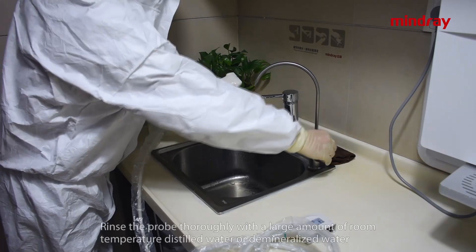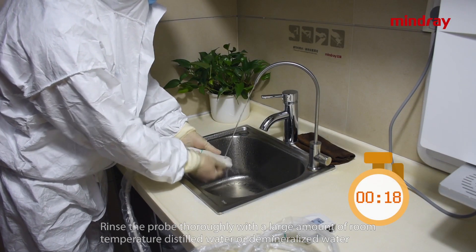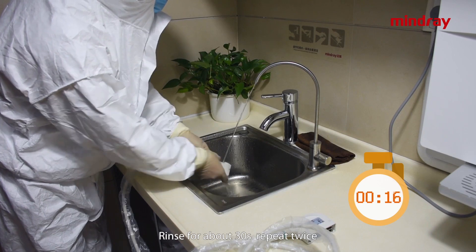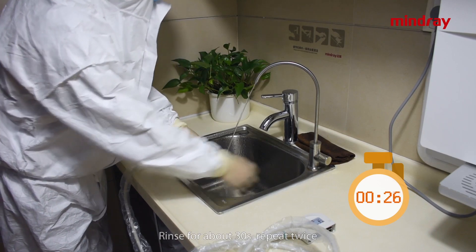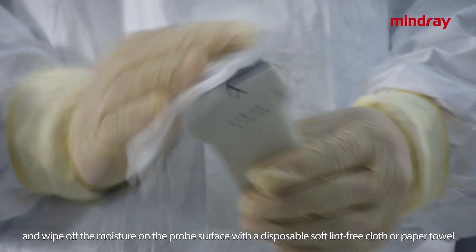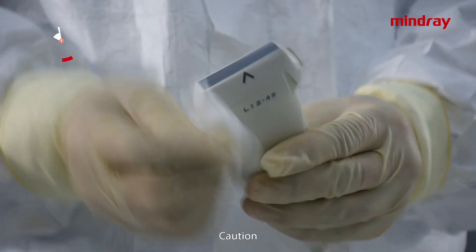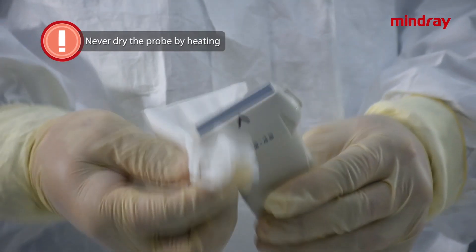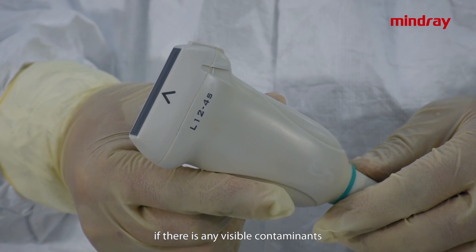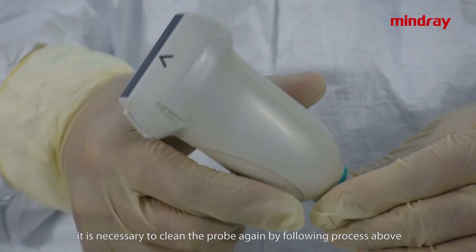Rinse the probe softly with a large amount of room temperature distilled water or demineralized water to remove residual dirt or detergents. Rinse for about 30 seconds and repeat twice. Wipe up the moisture on the probe surface with a disposable soft lint-free cloth or paper towel. Caution: never dry the probe by heating. Check the probe; if there is any visible contamination, repeat the cleaning process until the probe is completely clean.